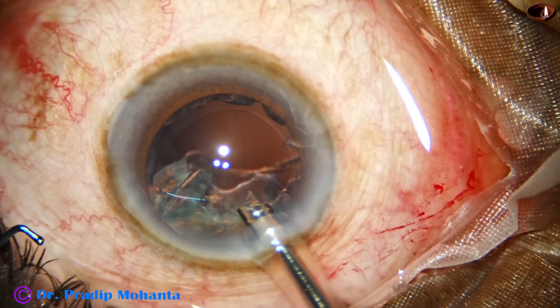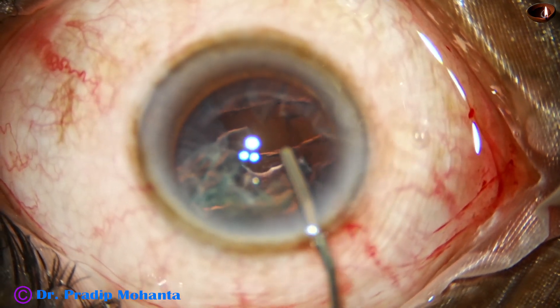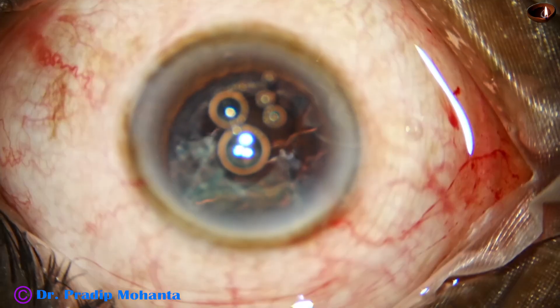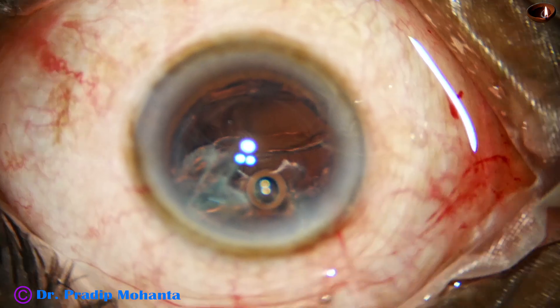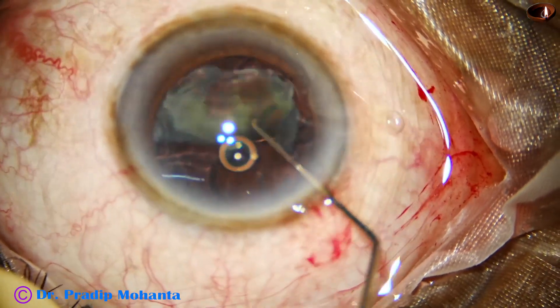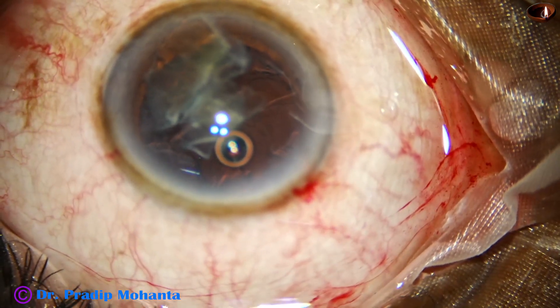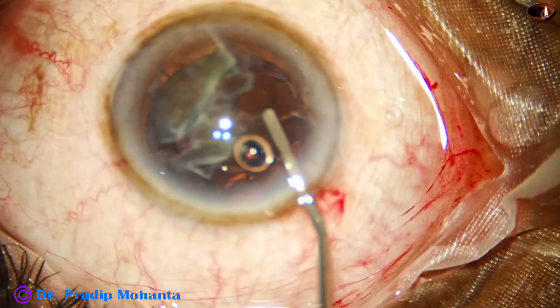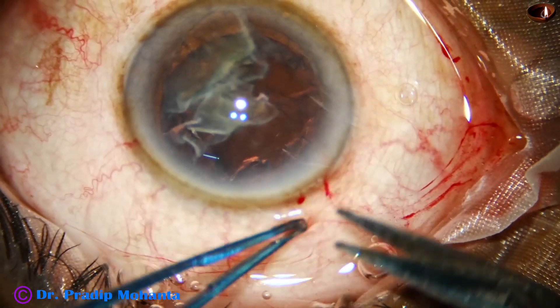There is still a portion of the nucleus remaining. This is chondroitin sulphate and sodium hyaluronate combination viscoelastic. It is placed and the rent is attempted to be sealed so that the nuclear piece doesn't drop into the vitreous cavity. Now I take a Szynski hook and manipulate this piece, bringing it out of the capsular bag into the anterior chamber. The viscoelastic substance — again chondroitin sulphate and sodium hyaluronate combination — is applied.